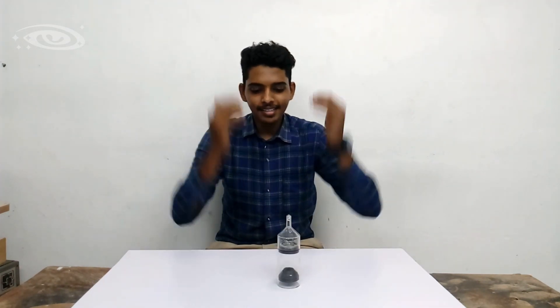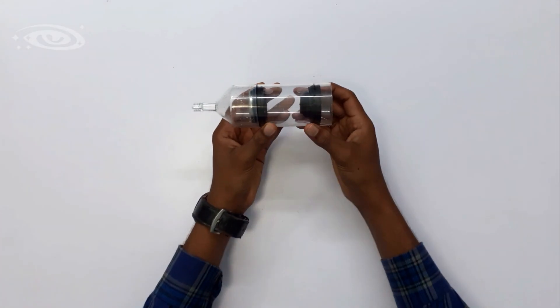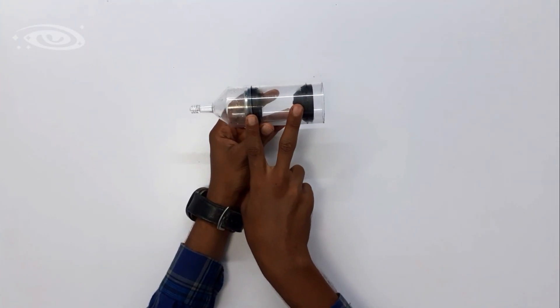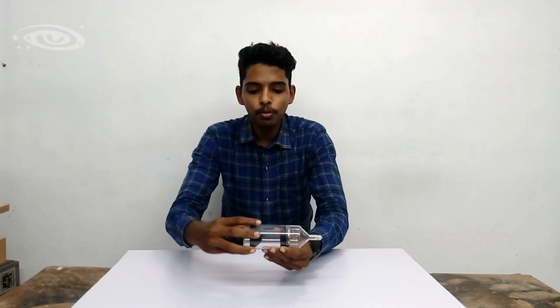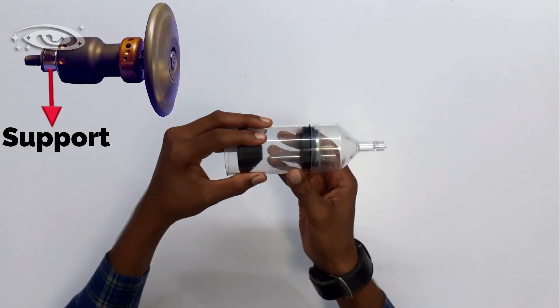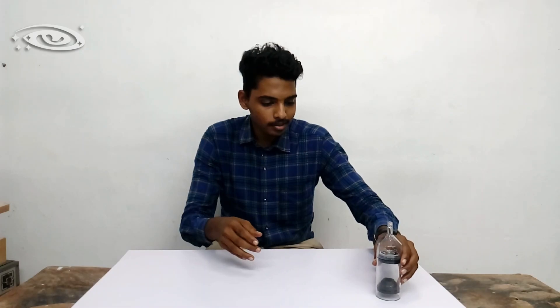Now everything is finished. Let me show the parts one by one. First we will see about the support. This is the support, and here in the support we have two bearings. For better understanding I have made this support transparent, but in reality this support is metal.